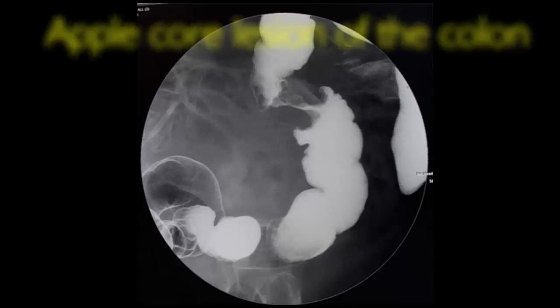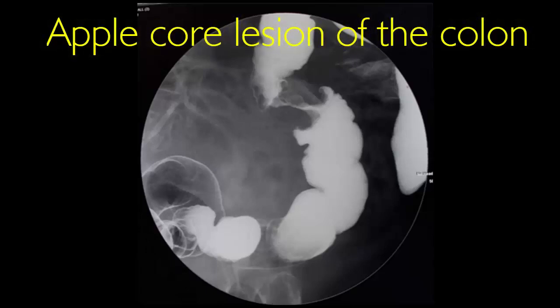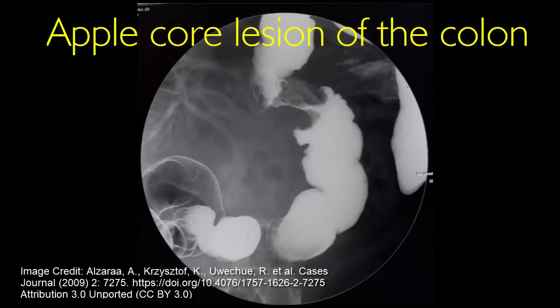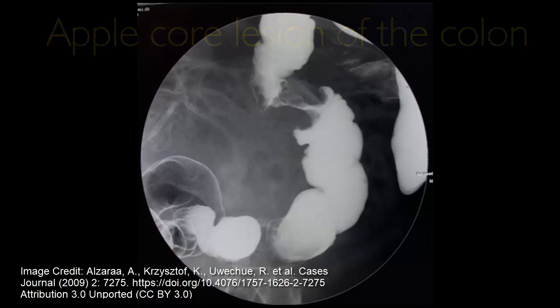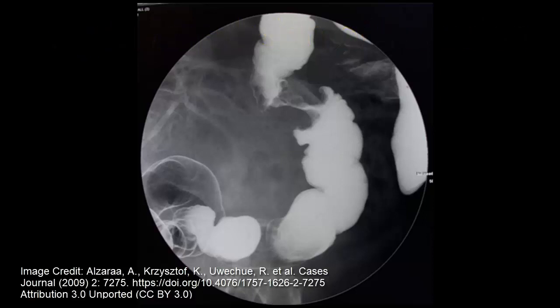Apple core lesion of the colon. In one of the lessons on intestinal obstruction we mentioned apple core lesion of the colon. In this video we will discuss a bit more about such lesions.